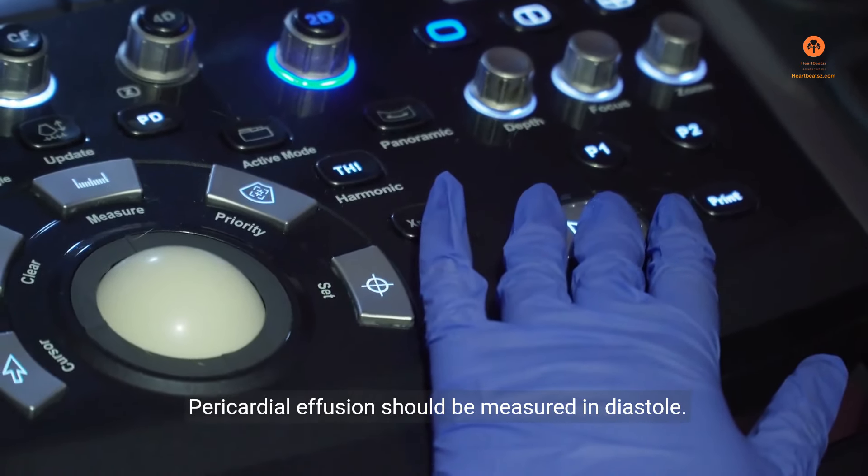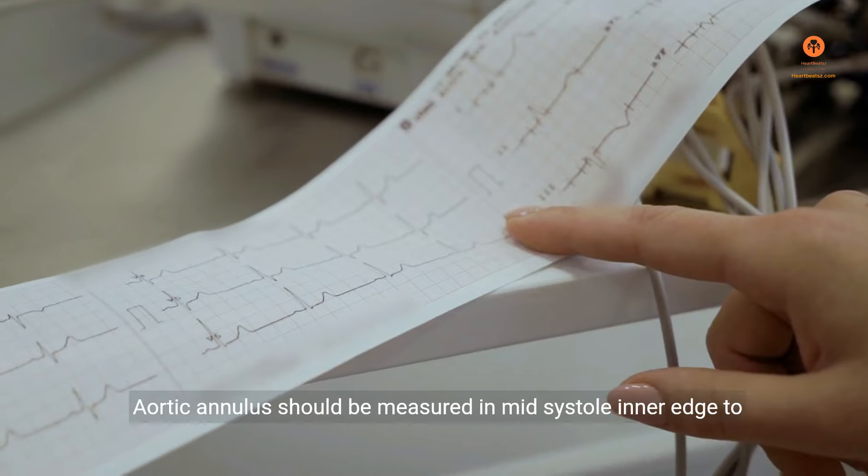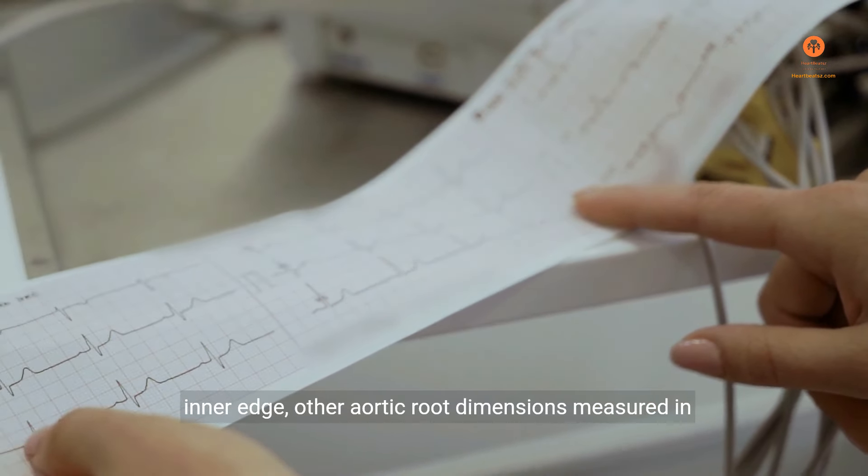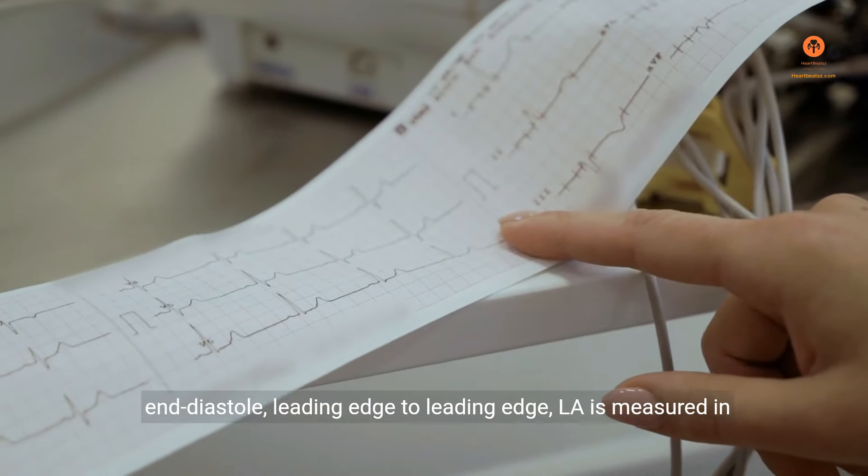Pericardial effusion should be measured in diastole. Aortic annulus should be measured in mid-systole, inner edge to inner edge. Other aortic root dimensions measured in end-diastole, leading edge to leading edge.